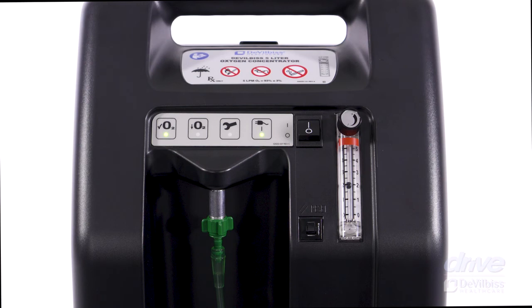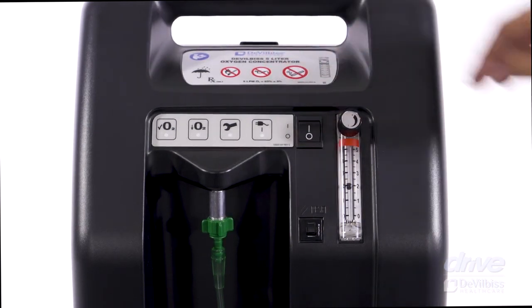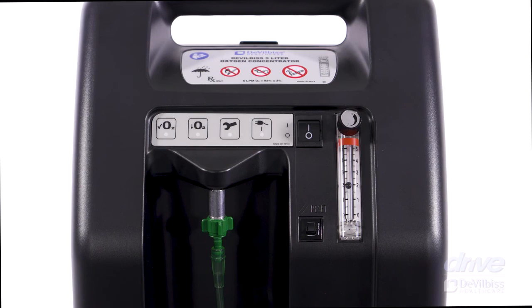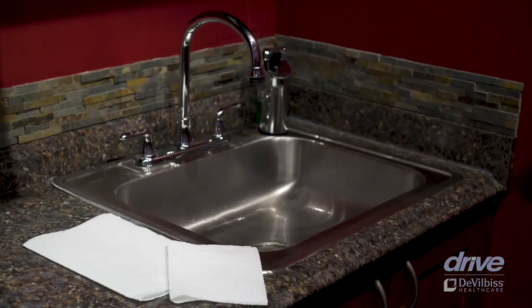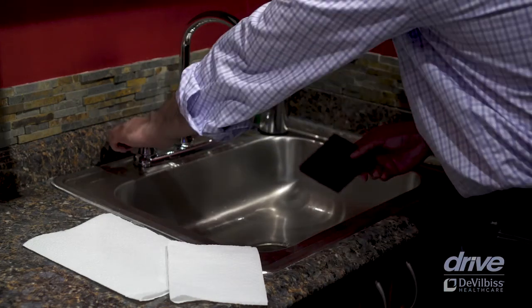It's essential to maintain your unit, cleaning the cannula or face mask, the exterior of the concentrator cabinet, humidifier bottle, outlet connector, and air filters periodically. Be sure the power switch is in the off position, indicating the unit is turned off before cleaning the unit. Clean and replace the cannula or mask, as well as tubing and humidifier bottle, according to the manufacturer's or your provider's instructions. Remove the rear cabinet air filter and outlet connector, and clean at least once a week.